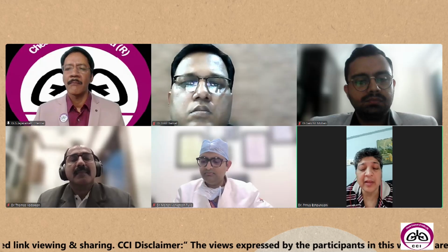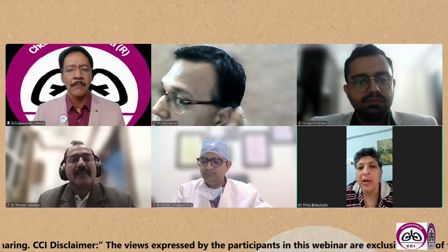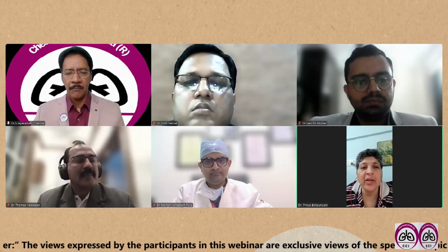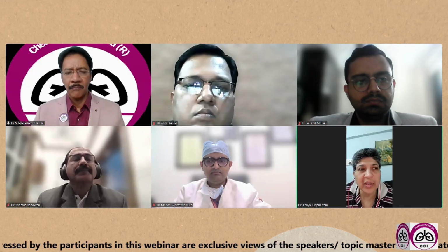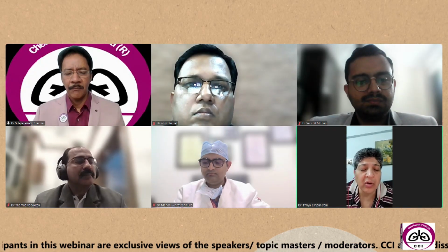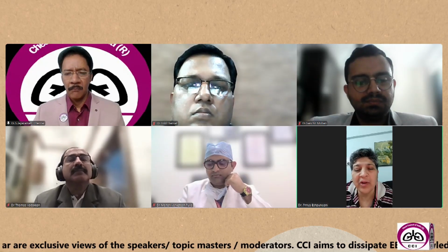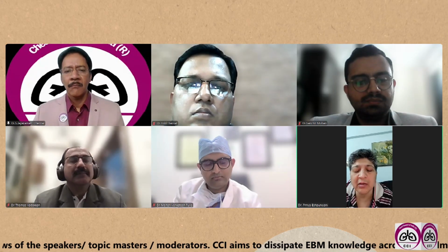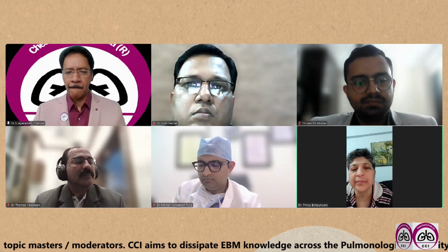It's never a great thing. Whereas VATS, video-assisted thoracoscopic surgery, is what we are trained in and out. So we have very good control over the procedure of VATS. With VATS we have more control, more expertise, and our dissection as well as our yield with control is excellent. So I think EBUS plus EUS is the way to go, and if ever the need arises, I think mediastinoscopy or video thoracoscopic surgery is the next alternative.